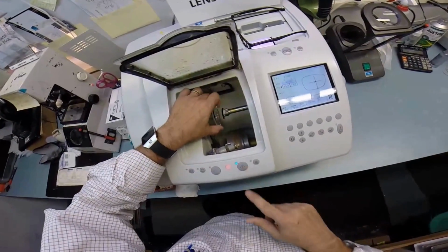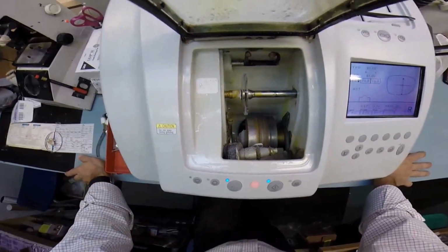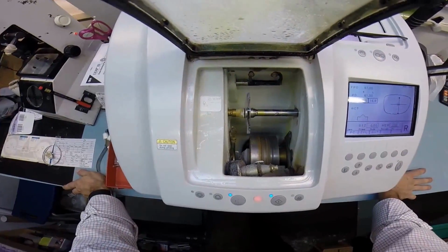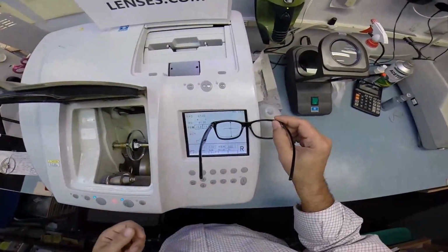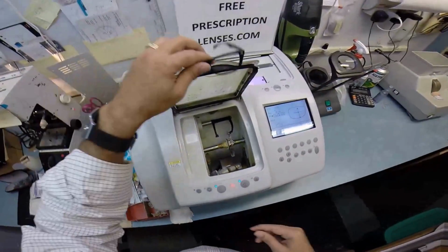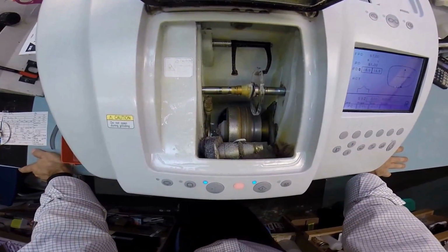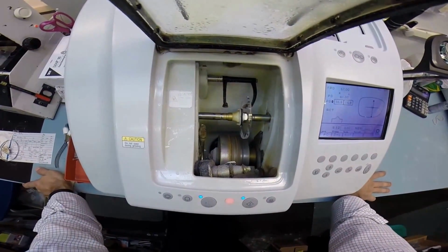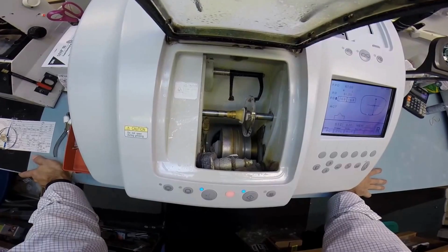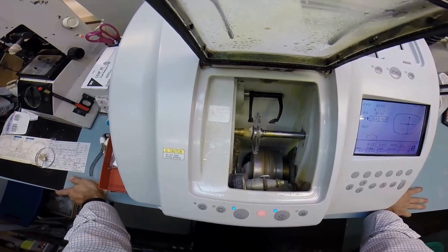I'm going to put your right lens into the chuck, or as you know by now, as I like to call it, the Charles. But the calipers are going to come down and it's going to trace the shape of the right side of your frame. Make sure that is correct. Yes, the right side of the frame. To make sure the lens will fit, it starts on the concave surface, which is closest to the eyelashes, the rear surface. And then it's going to move over and trace the convex front surface of the lens, all the while measuring the thickness of the lens as it goes around.